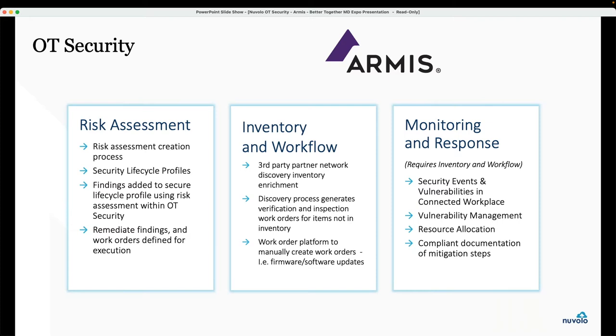And it's got to be bigger than HTM. Because even to your point, we were talking about the risk assessment and how it can be done before you have the model. Is that going to be a procurement task or is it going to be an HTM task? These are the questions you have to answer.